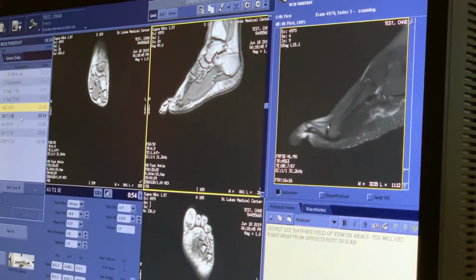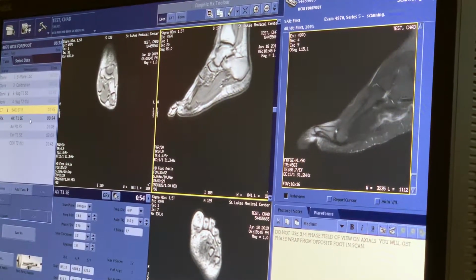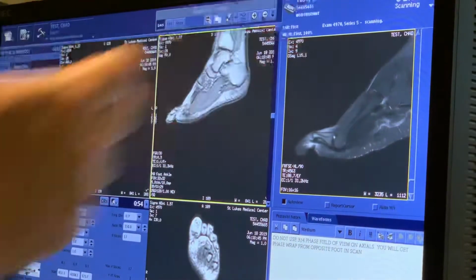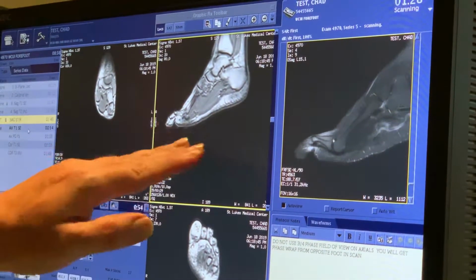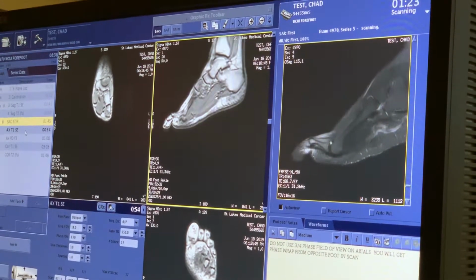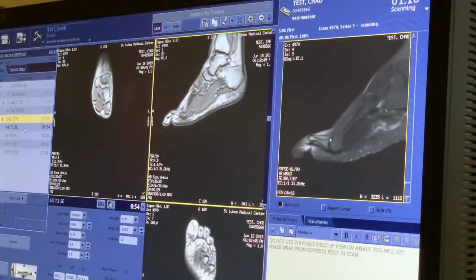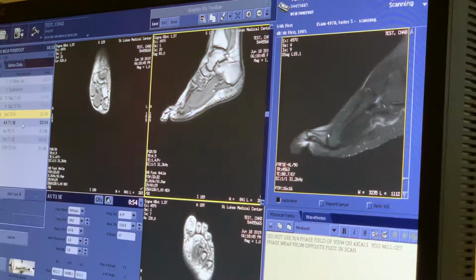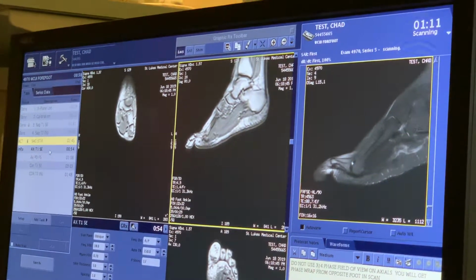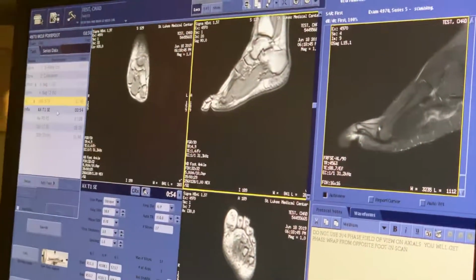Professionally, I refer to them as a short axis axial versus a long axis axial. This is the long axis of the foot. This is the short axis of the foot over this way, right? So when somebody comes up to you and says, I want an axial of the foot, you can say, well, is that a long axis axial or a short axis axial? Because different facilities will do it differently, and you kind of have to be aware of that, okay? This facility, an axial is the long axis axial, like that, okay?